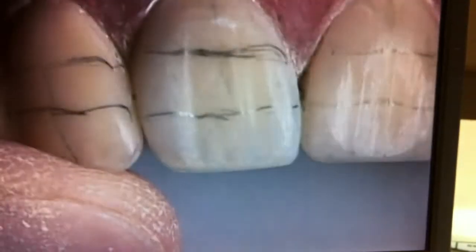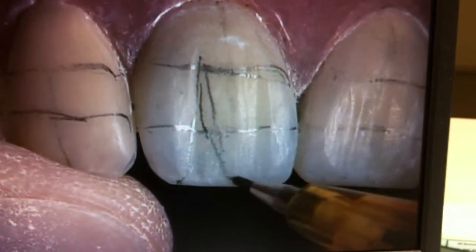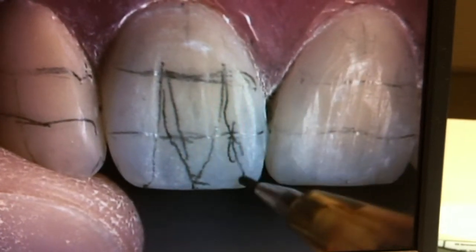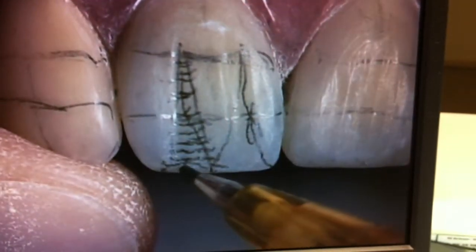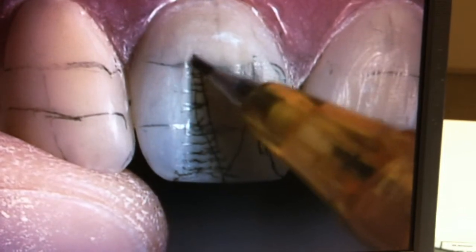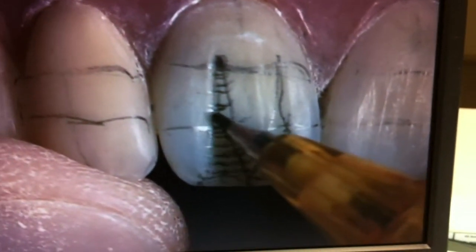Let's go back to fundamentals. Point angle, base of Eiffel Tower, up, come down, and curve towards the center lobe. Up and down towards the point angle. You've got to have this delta here, all right? And as the delta narrows towards the high point of your Eiffel Tower, it becomes slightly shallower, and then all of a sudden it comes and comes and comes and disappears.